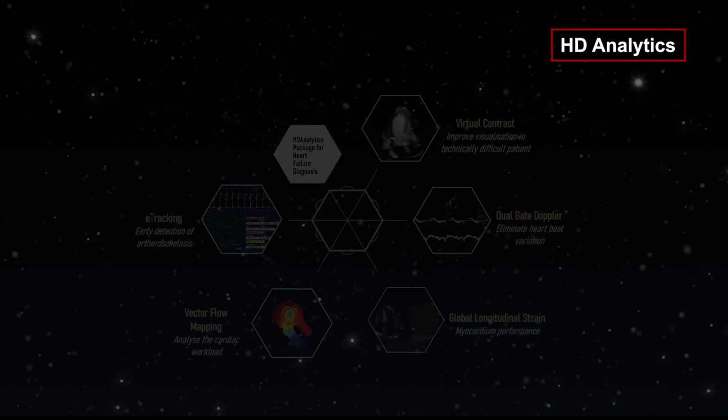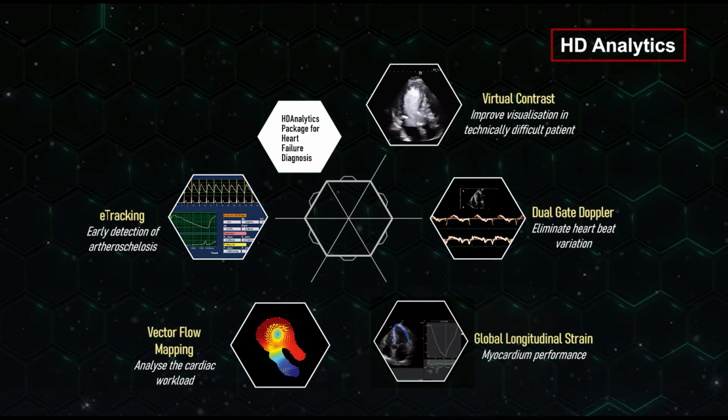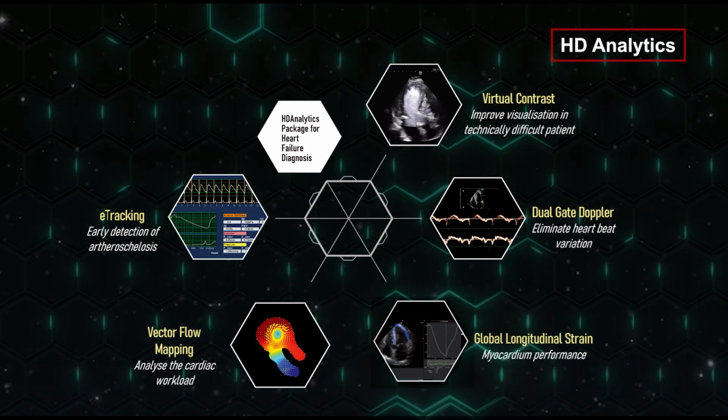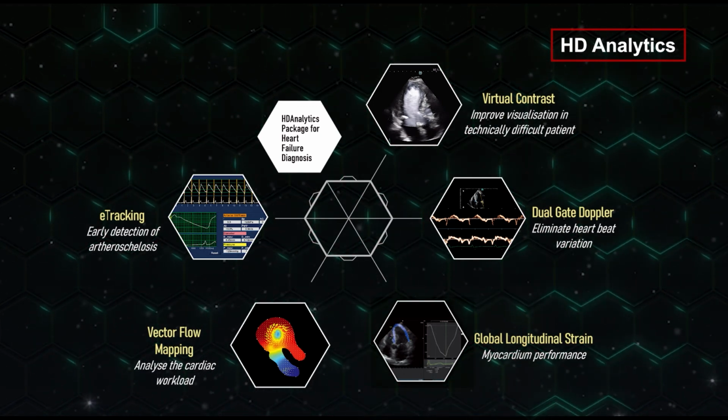Fujifilm's Hemodynamic Analytics goes beyond the evaluation of cardiac anatomy and function, achieving more reliability for diagnosis and treatment of cardiac disease.